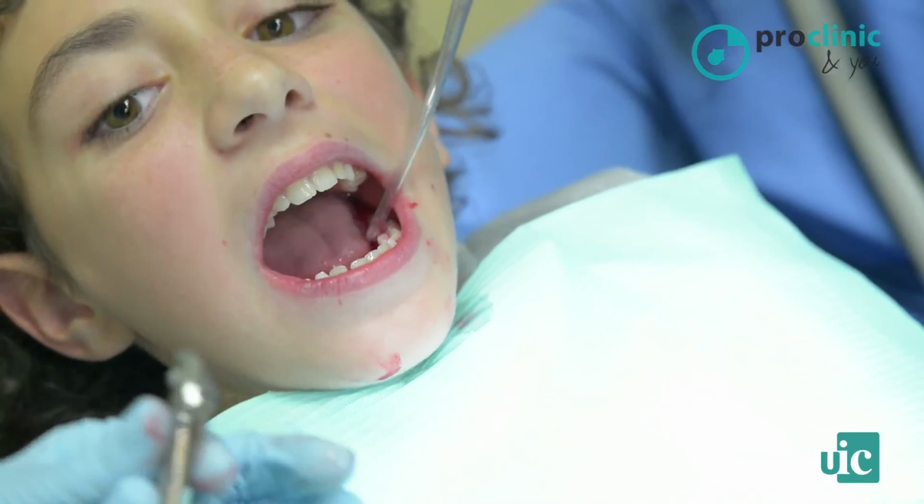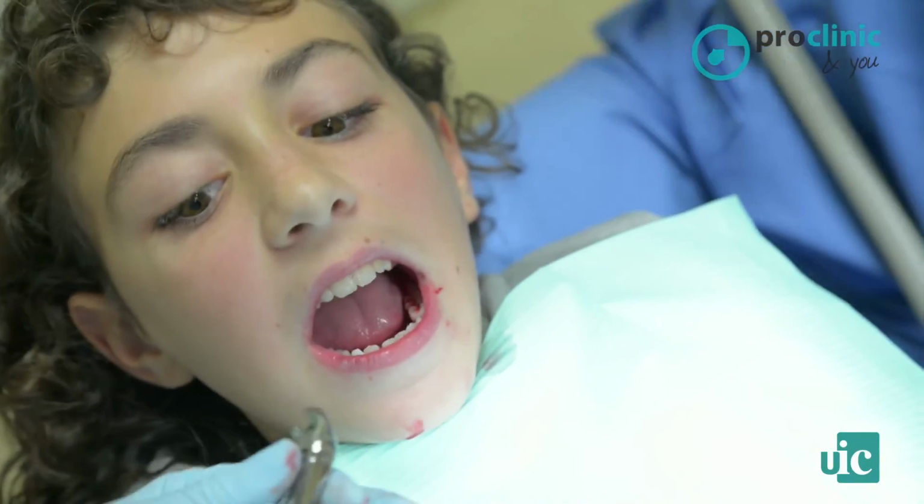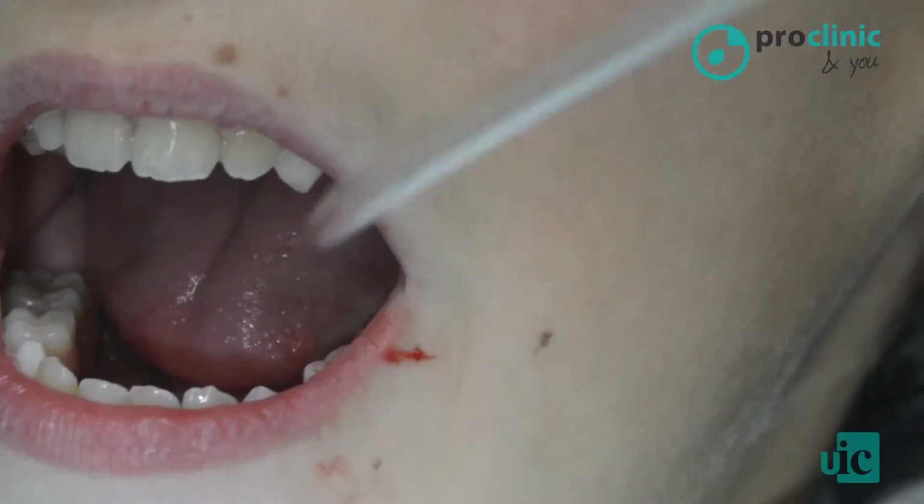Now we are going to remove the tooth with tweezers. If you hear a little noise, don't panic, nothing happens.